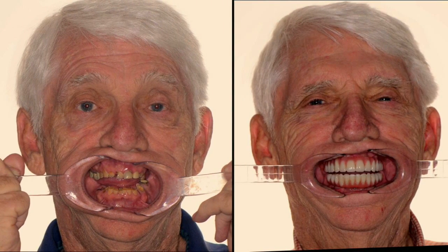When you look at the flange there, remember that doesn't wrap over the tissue. The base of that hybrid is convex against the convex tissue. So he can put a water pick right through there.